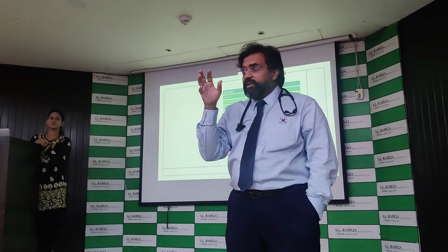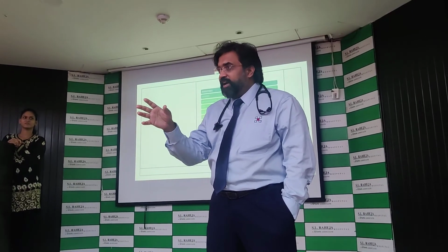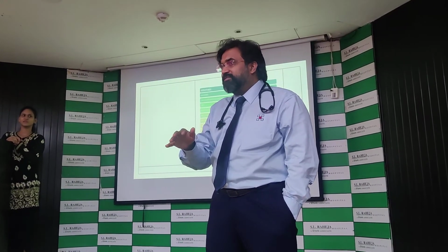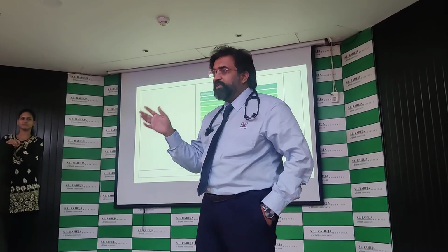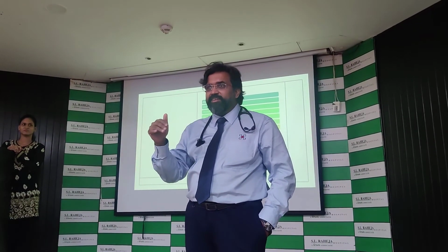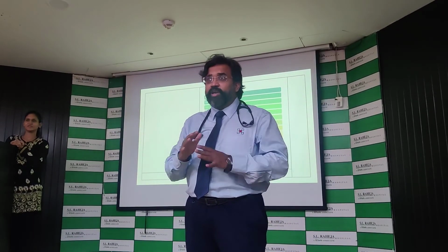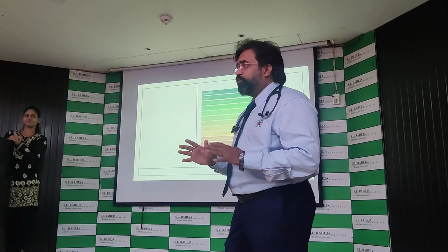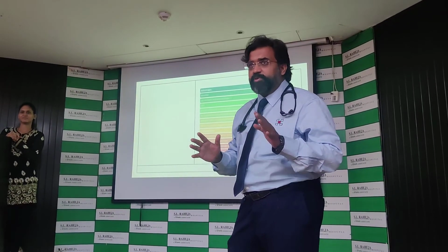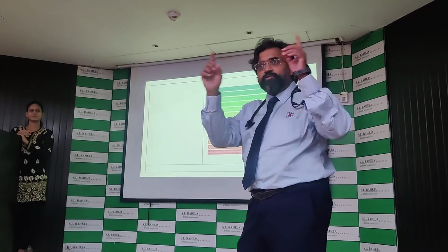If there is electrical impedance tomography that we've been doing, what will we realize? That this PEEP is adequate or not, or whether it's causing overdistension or not. You got the point. So if this is coupled with an EIT, it will become the best thing in the world to ventilate with. Full artificial intelligence, nothing to worry about, full knowledge base. It will become perfect. Imagine we have this ASV and we are using the EIT belt.